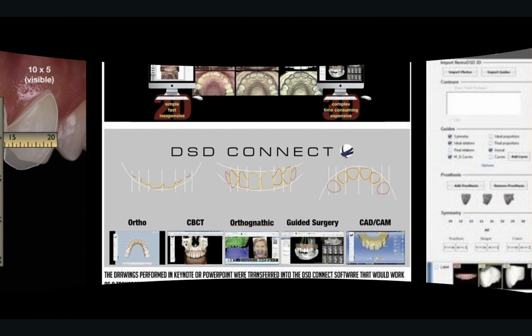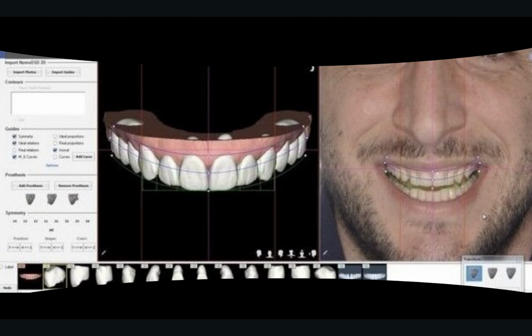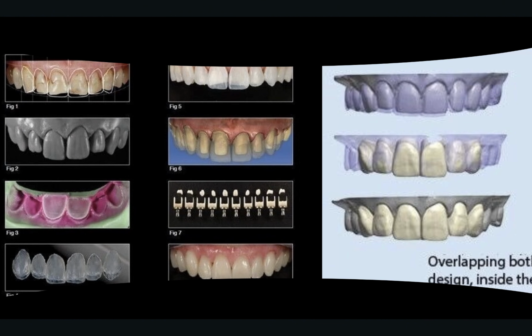Guided surgery was a big change, being able to have that 3D imaging and that CAD CAM workflow designing and using natural files that we could preserve the fidelity of through fine and detailed milling with monolithic restorations. We had 3D printing, which was a huge game changer, and the changing of that to become something that was more and more affordable to the average dentist. And lab.